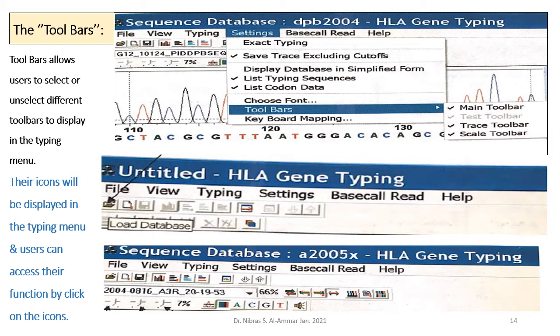Their icons will be displayed in the typing menu and users can access their function by clicking on the icons.